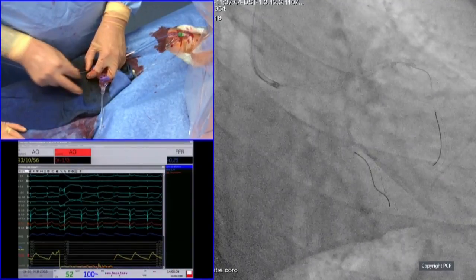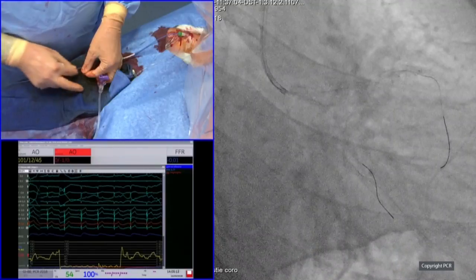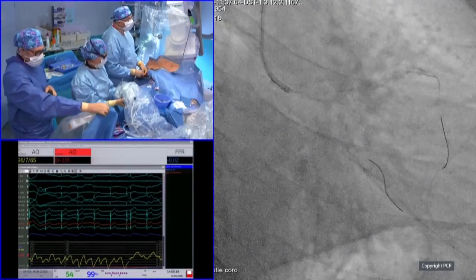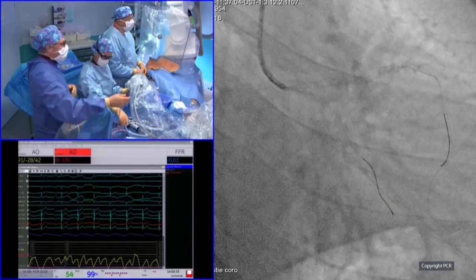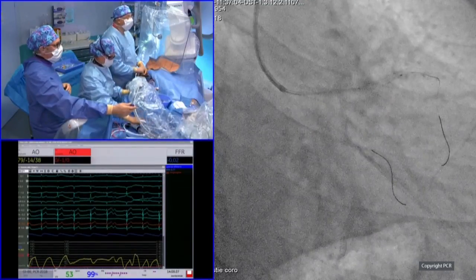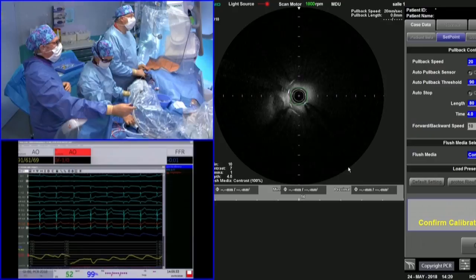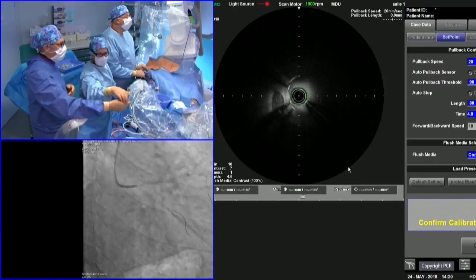Yeah, both ostia are perfect. And of course, it's proximally that probably needs some more expansion, despite the nice angio result. Maybe, because you will begin to be short in time, do the OFDI, and while reconstructing the images, do the pot and the final images to conclude. Okay, perfect. Yeah, and I will go to the time to react while you are doing that.